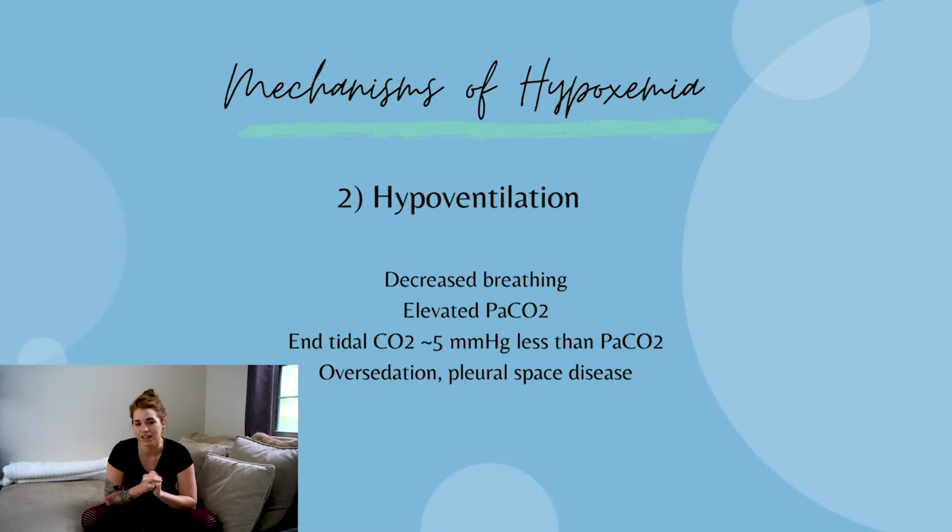One way we can measure this outside of using some kind of blood gas instrument is if our patient is intubated, we can quasi-measure PaCO2 by measuring our end tidal CO2, or the amount of CO2 that our patient is exhaling. This is roughly 5 millimeters of mercury less than our PaCO2, but it is a good measurement to see if your patient is hypoventilating. If our patient is hypoxemic from hypoventilation, they should respond to oxygen support.